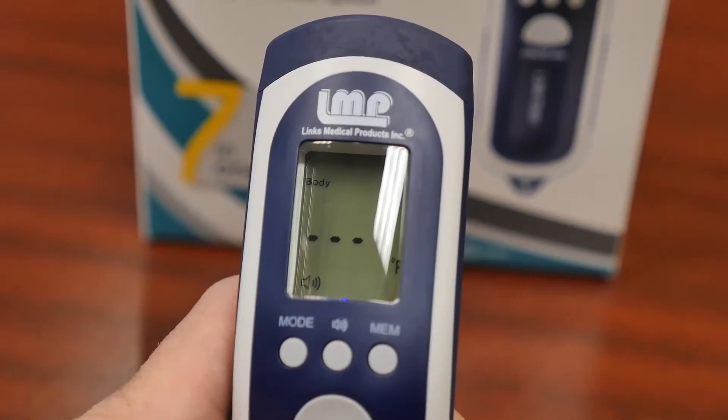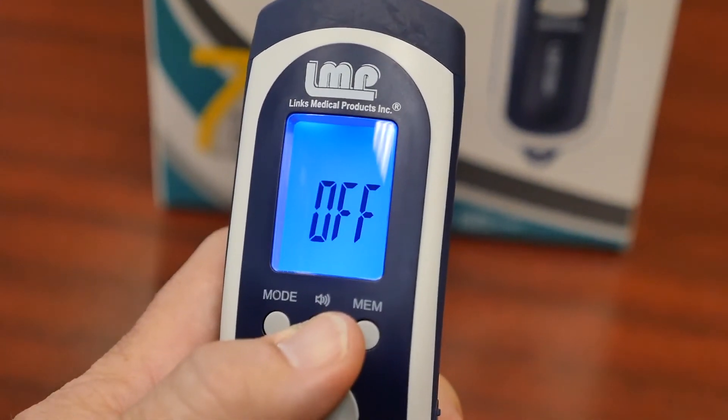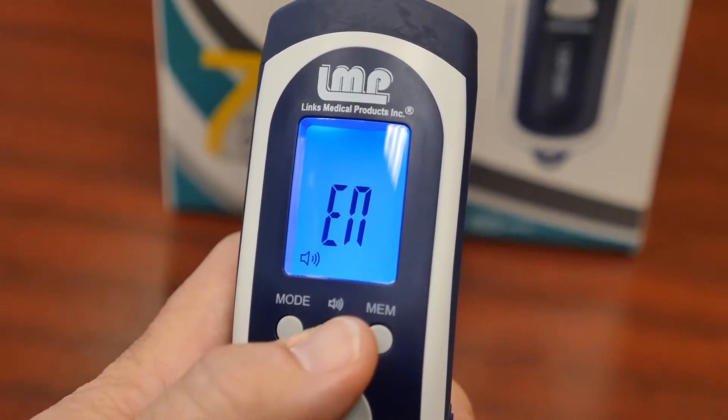While the thermometer is turned on, press the audio on/off button to toggle between English, Spanish, and audio off.